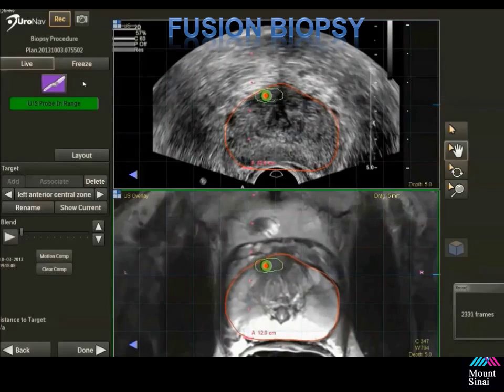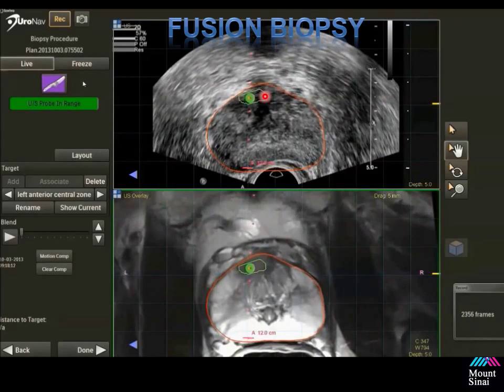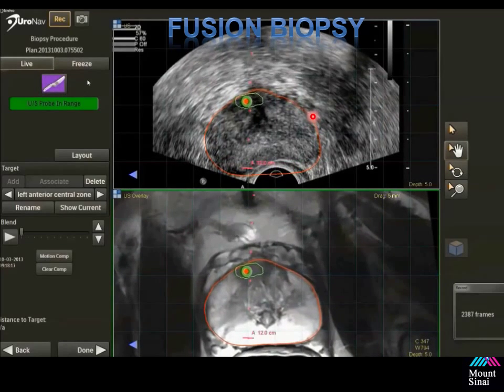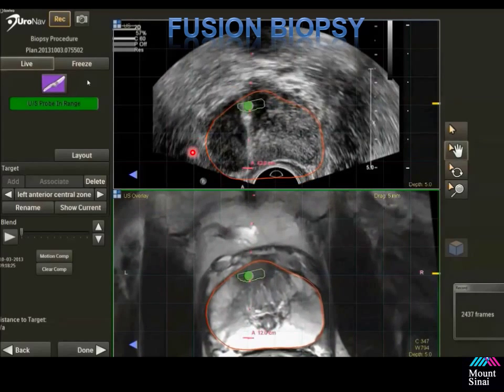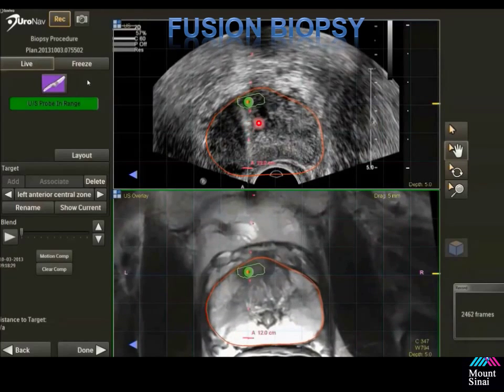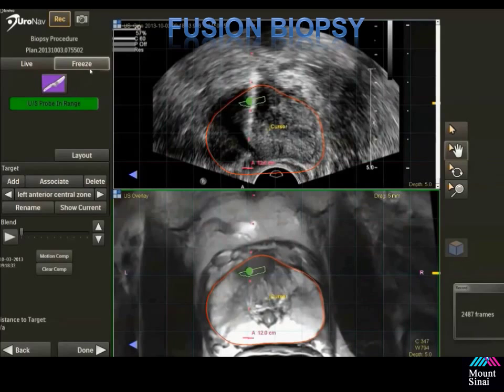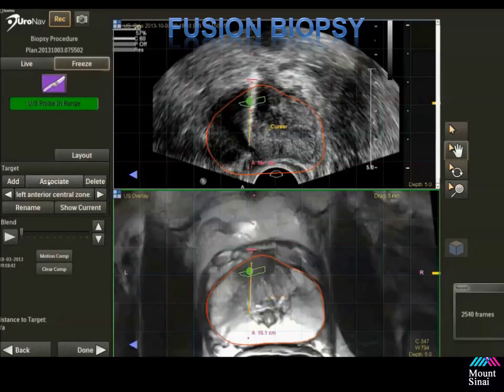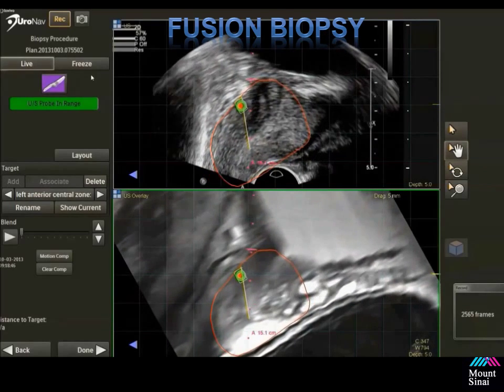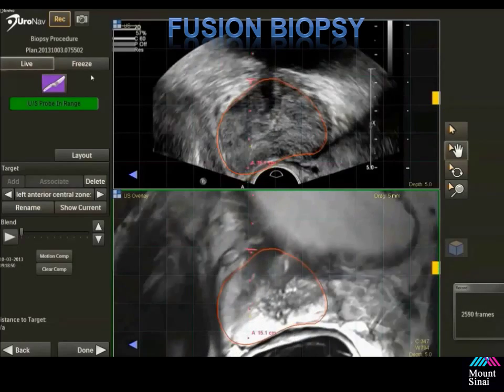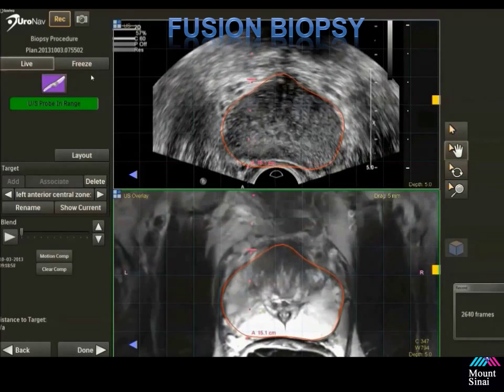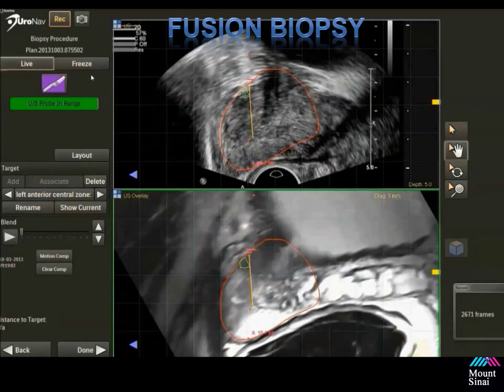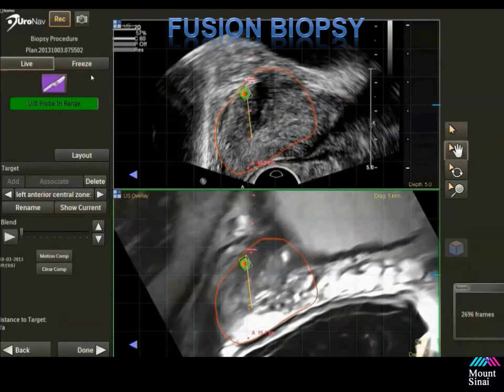This is the same patient from the beginning. Notice the target and the segmentation. During the procedure you should be looking at the red outline, confirming that the ultrasound correlates. There's some deformation here; however, the outline is very nicely aligned. We're able to place our needle up to the level of the lesion and then fire the biopsy gun, sampling the anterior portion of the prostate. Notice how this is almost two centimeters before the lesion starts — most biopsy needles do not reach this point. We align, mark where the lesion is, and perform this in the sagittal plane. I typically take two biopsies per lesion. The bottom screen allows you to look at your MRI and look for internal fiducials to confirm your targeting.